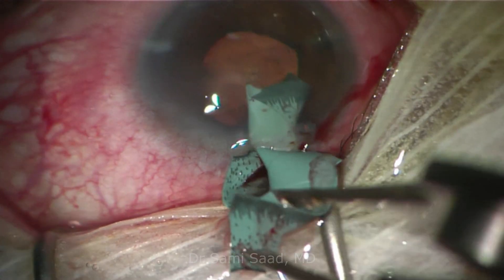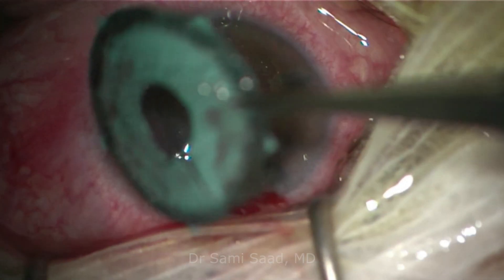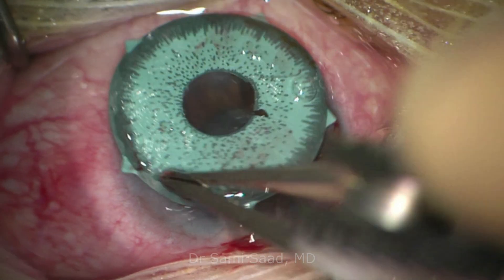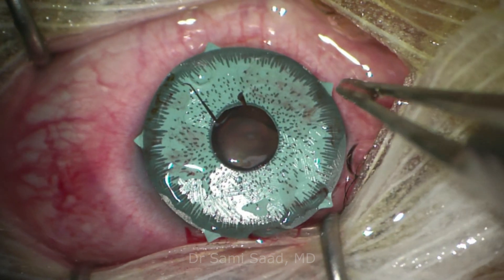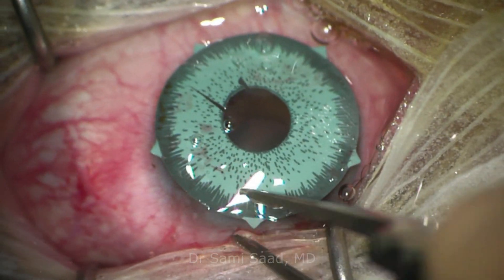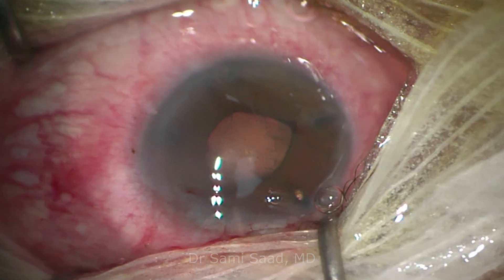we use Chang IOL cutter scissors to create a tab in the inferior part of the device. We then use a micro forceps such as Macpherson forceps to remove the device from the anterior chamber.